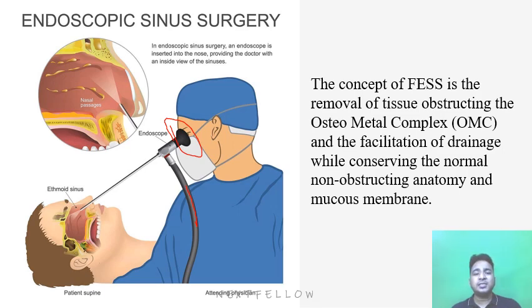So the concept of FESS basically is the removal of tissue from the osteomeatal complex. Any sort of sinusitis, any sort of polyp, any sort of hypertrophy of the mucosa. By means of FESS, we will introduce the endoscope into the nose, into the sinus.